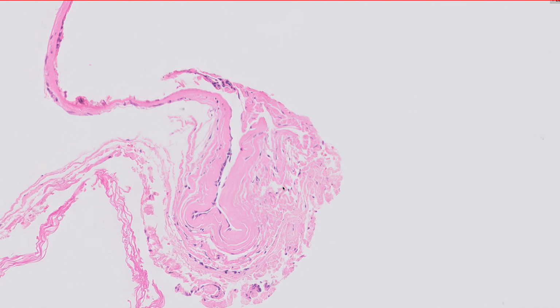which you can see here. And one little pitfall of this is that when strips of this split cyst wall drop off, you can see an appearance rather like we're seeing here, fragments of tissue where you get what looks like a single cell, rather columnar looking epithelial lining with an underlying fibrous wall. And this can very closely mimic a hydrocystoma of skin.